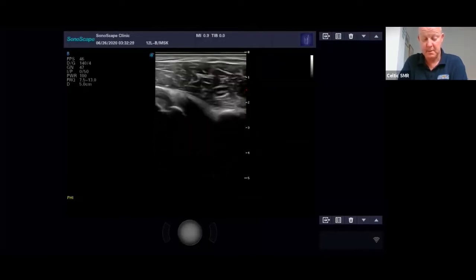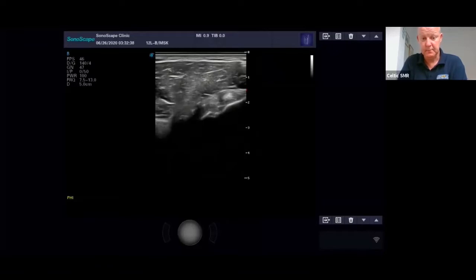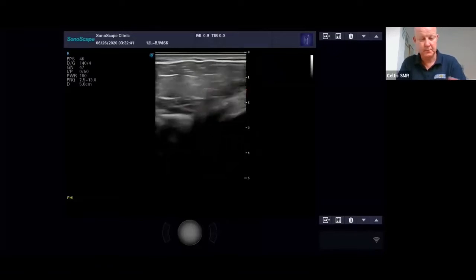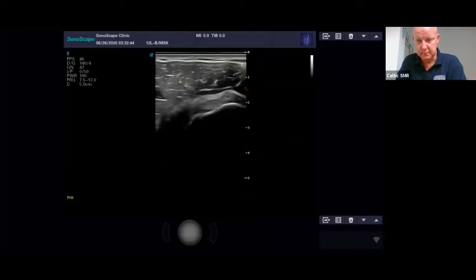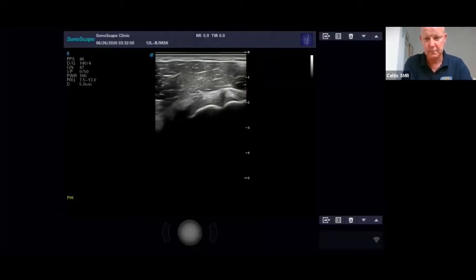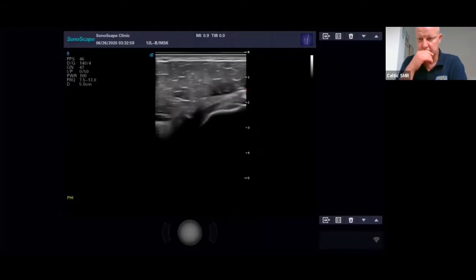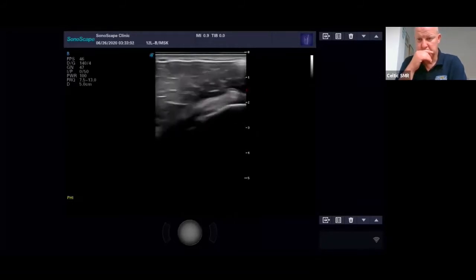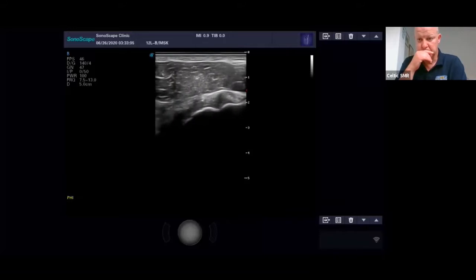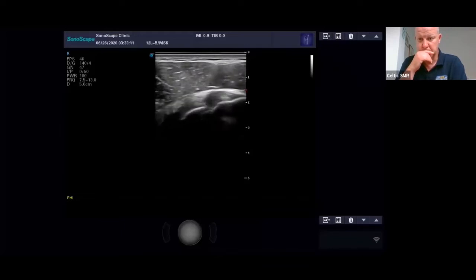The only problem with doing this is that it will tend to give you a little bit of repetitive strain injury. So if you're doing a lot of scanning all day, this is probably not the best position to get yourself into, because you've got to hold your hand at a certain level, especially if you're sitting down, your hands high up. That's why I tend to scan from behind the patient. It can be a little hard to interpret the image that way, but you do get used to it. So I'd recommend that if anyone's with your practice.